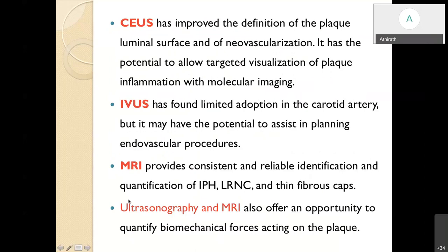Intravascular ultrasound is an invasive imaging technique, but it assists in planning an endovascular procedure. MRI gives us information about numerous complications of a vulnerable plaque, like intraplaque hemorrhage, lipid-rich necrotic core, and thin fibrous caps. Ultrasonography and MRI together offer an opportunity to quantify biomechanical forces acting on the plaque.